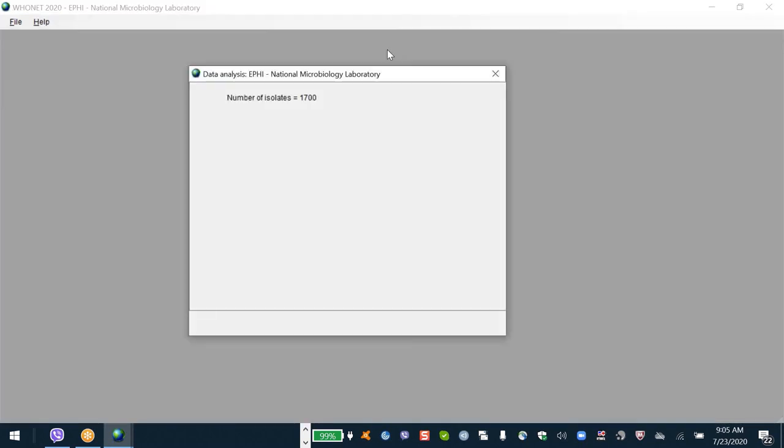Or if you're the national data manager, you're busy people, you know, it's nice to have a nice simple way. And here it's also separated by lab. So you can see that lab 01 has these quality issues. Laboratory 001, which is the same lab, has these issues. So you can see which quality control issues each of the different laboratories have.